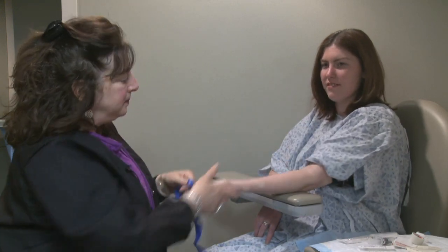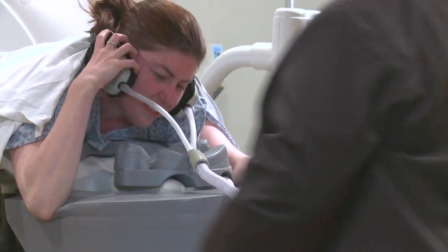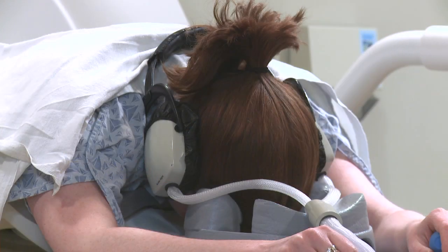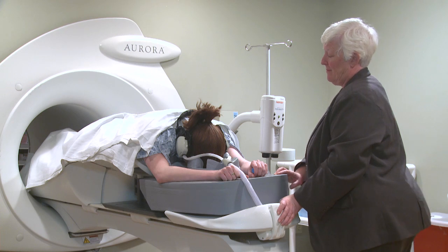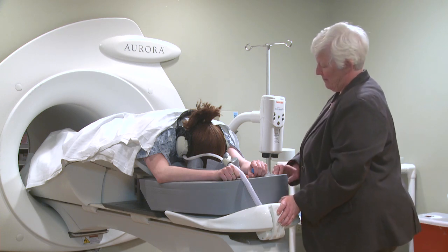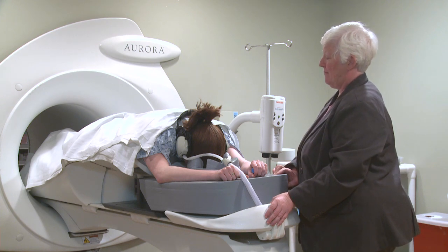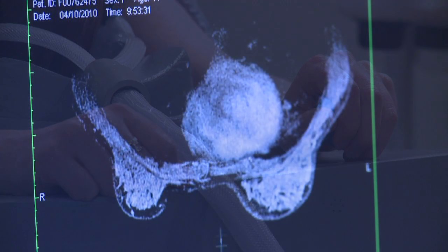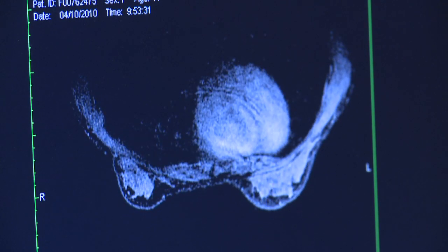So now that the IV is in, we're going to go into the room and set her up into position. We've brought the patient into the room and set her up onto the table. We've given her some earplugs to protect her hearing as well as some earphones. We've put her into a coil where her breasts are hanging down. We do leave the gown on so that it will help with the motion of the breast. We've hooked the patient up to an IV because we'll be taking some pictures and then giving her the injection of the contrast material.